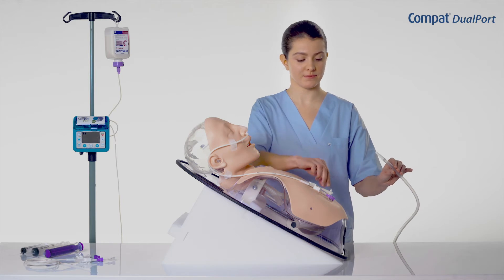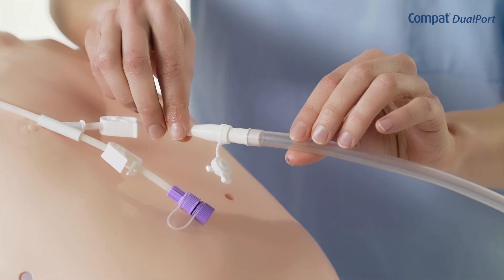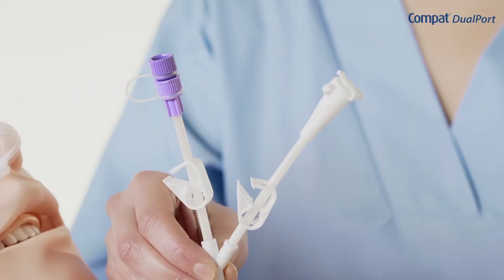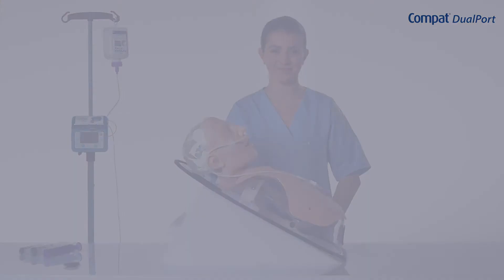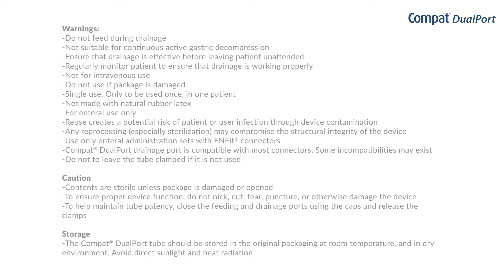Compact Dualport can also be connected to a wall suction device. To do this, please refer to the product's instructions for use and consult your institution's procedures. Do not use the feeding and drainage lumens simultaneously. Outside of the enteral feeding and drainage phases, the two ports of Compact Dualport must be kept closed using the caps. The clamps must remain open so as not to damage the tube integrity.